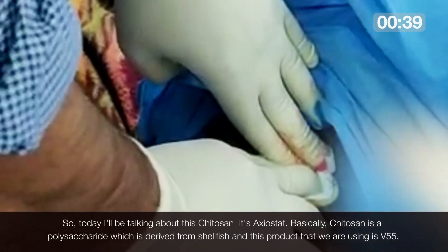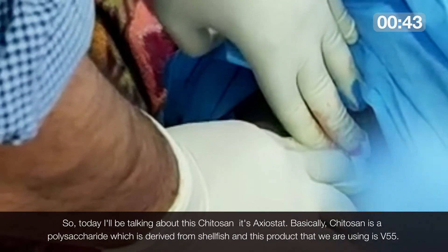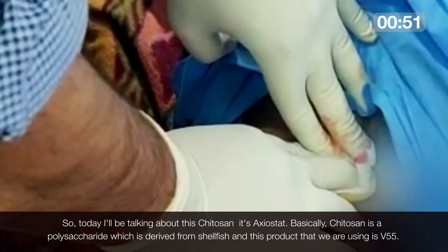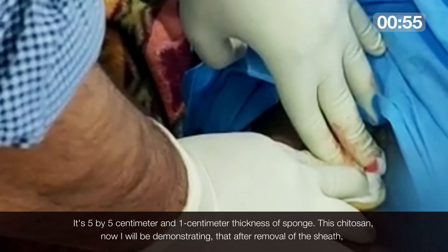Today I will be talking about this chitosan — it's called Axiostat. Chitosan is a polysaccharide derived from shellfish, and the product we are using is V55 — it is 5x5 cm and 1 cm thickness sponge.